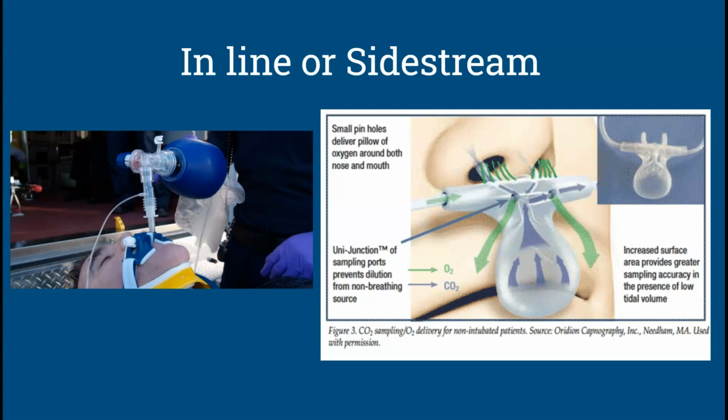You need to make sure that no matter which capnography you're using, that you plug it into the monitor first and let it zero. Okay, it's sort of like when you decide that you're going to use your kitchen scale for counting your macros or whatever. You don't want to put something on the scale and then turn it on, because it's going to assume that's zero, right? That's the starting point. If you want to measure something, you need to take it off the scale, turn the scale on, and then put something on it. Same thing with your capnography.